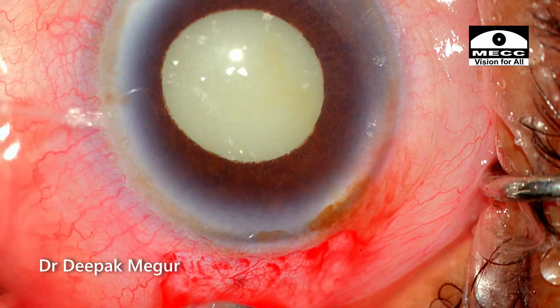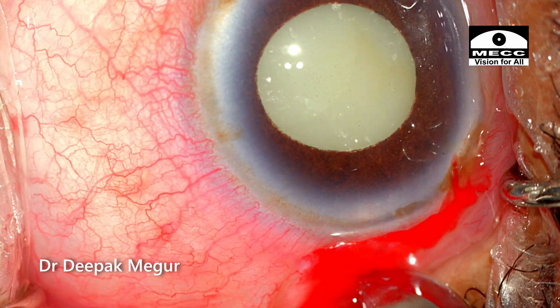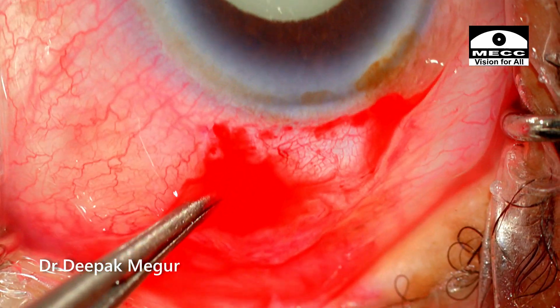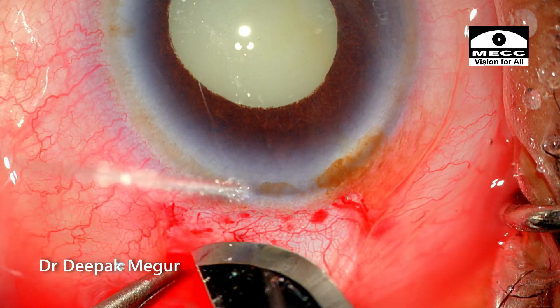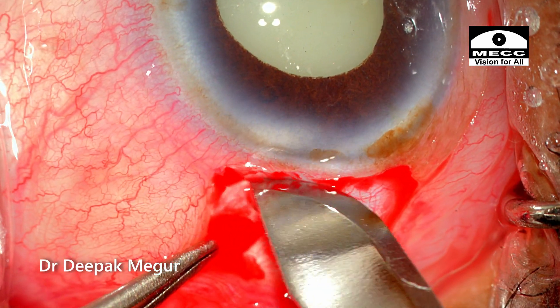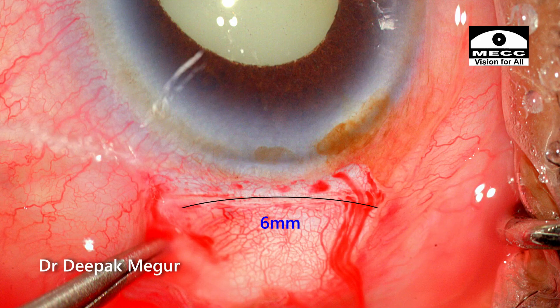I always begin by making a small posterior groove for gripping the globe while I am doing my tunneling — this is the way I fix my globe. A 6mm long partial-thickness groove is created using a number 15 blade.